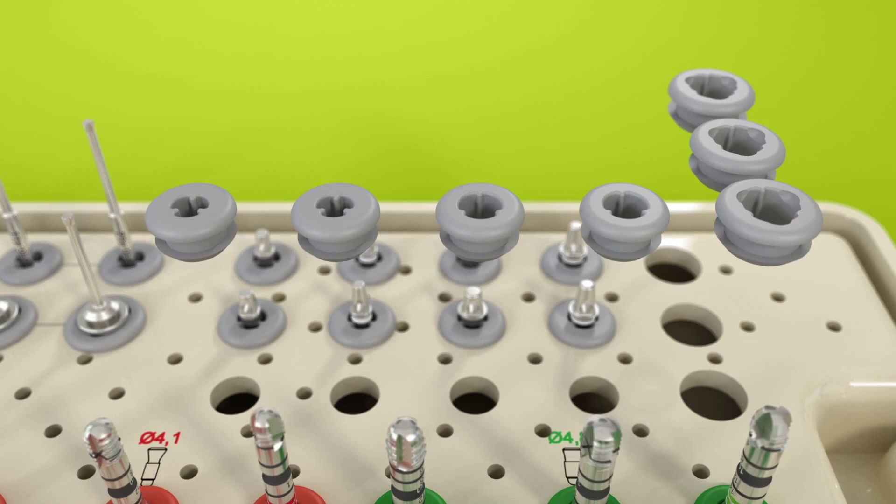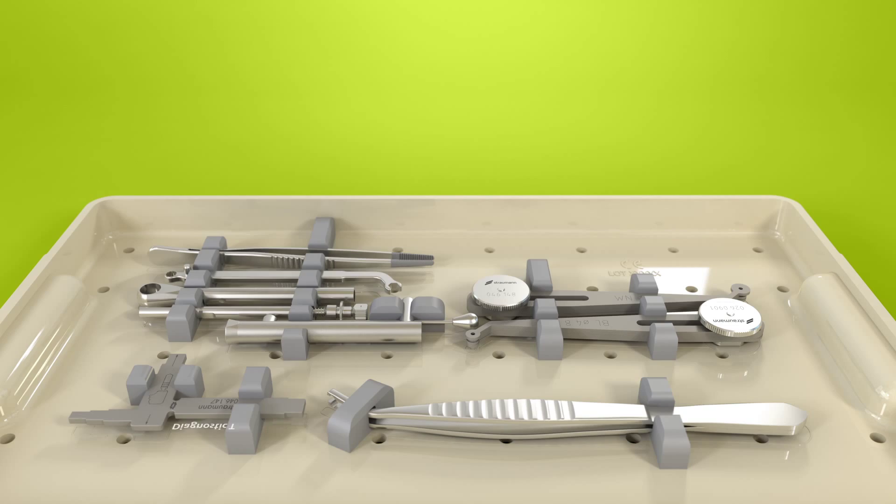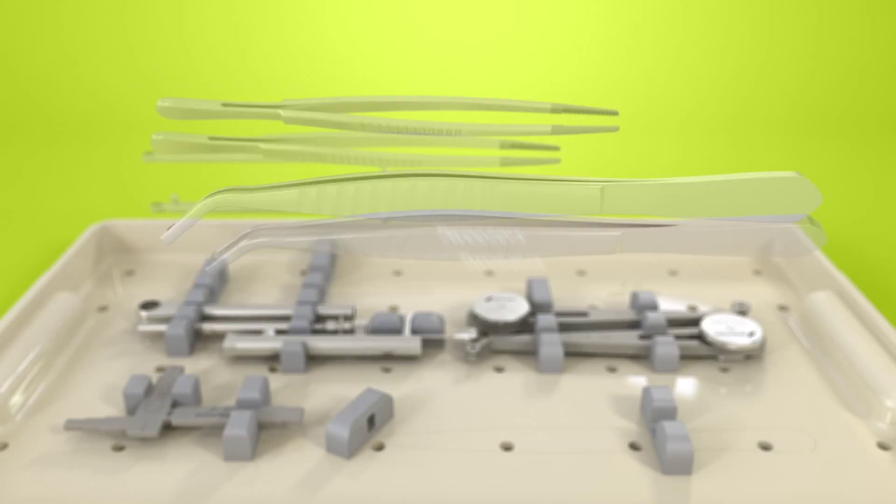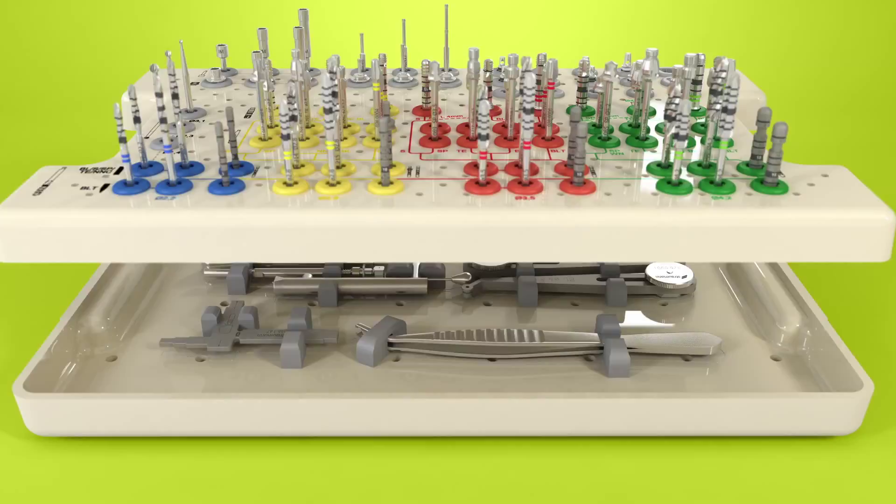The remaining gray inserts are left for other instruments that the clinician may need. The lower tray of the surgical cassette is set aside for storage of the diagnostic T, the distance indicator for bone level and tissue level implants, the ratchet, the torque control device, the holding key, and short and long tweezers.